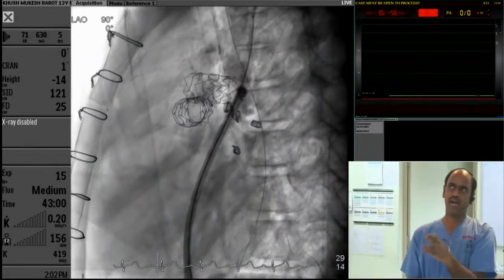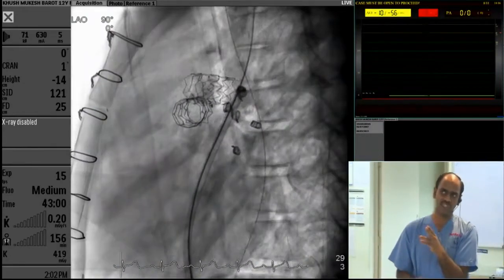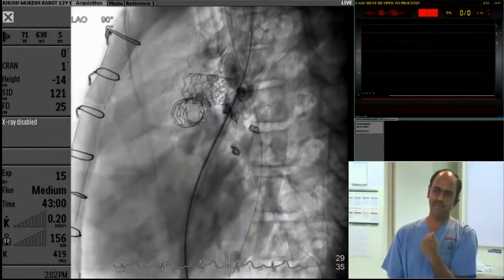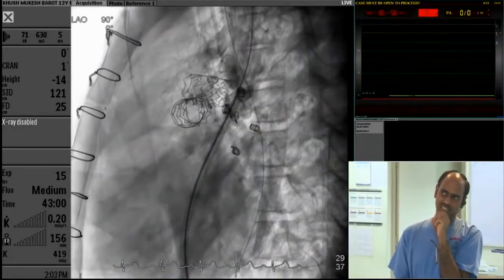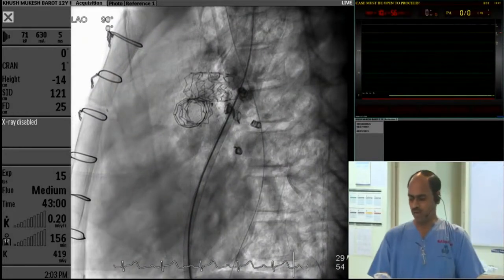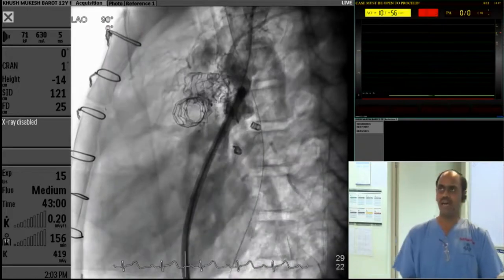What I did was, at this particular position, I took my stent inside. Towards the place just behind one major coil overlapping the sheath, there is some amount of waist — that waist I targeted. Second blunder: at this moment I had not done an AP projection.